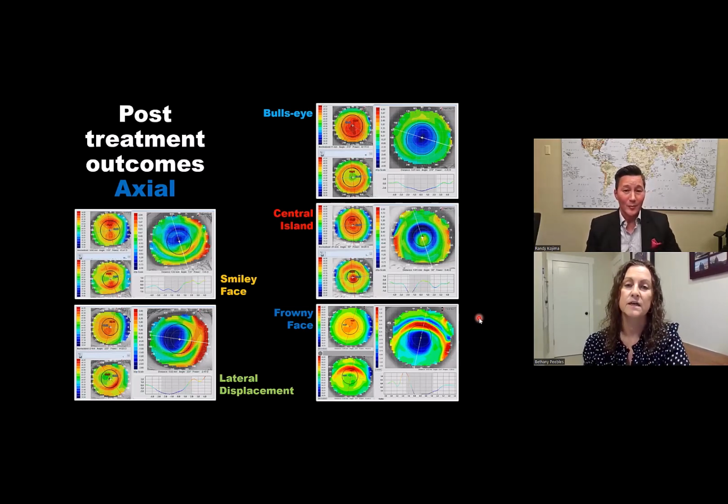Yeah, definitely. Honestly, that's a question that we're asked a lot: what is happening most often that you need to change? And that's a difficult question because it's really different for every patient. If we saw that lenses were constantly riding high, we probably would change our algorithm to correct for that. So the key is really that, yes, the majority of the time they're going to center pretty well.